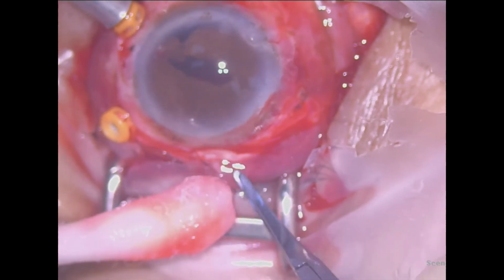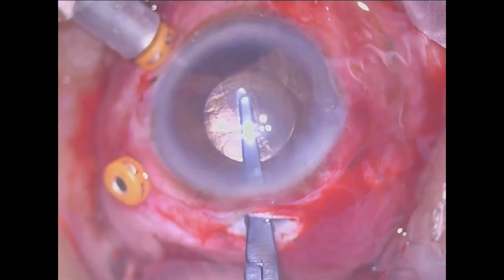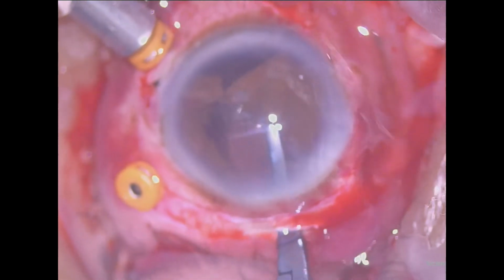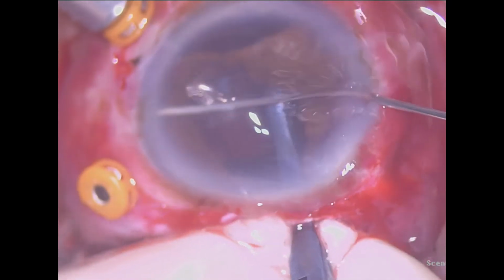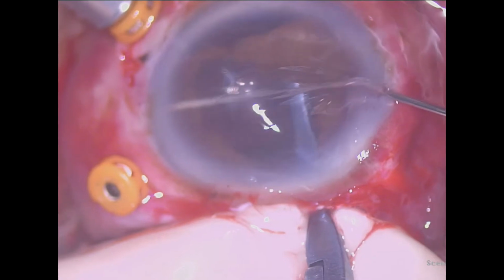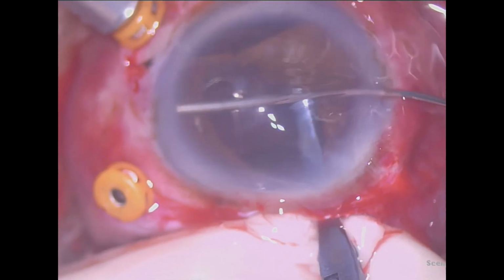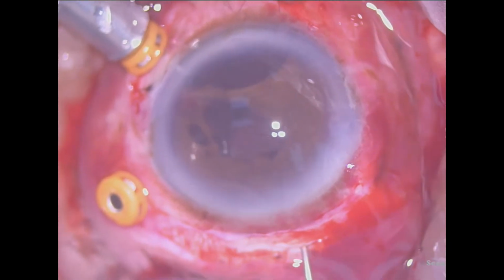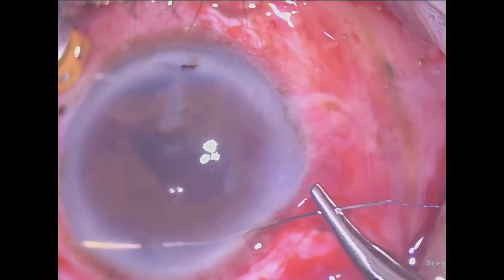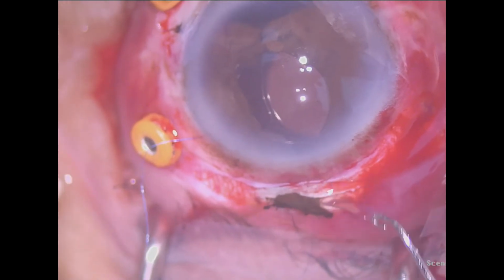Now, iris claw lens is inserted into the anterior chamber after filled with viscoelastic, and then the lens is rotated into horizontal position. Cannula attached to viscoelastic pass through the paracentesis. The first enclavation of the iris is done nicely, but the second enclavation pierced through the iris tissue. Again, superior iridodialysis is repaired and now the lens positioning at the center.